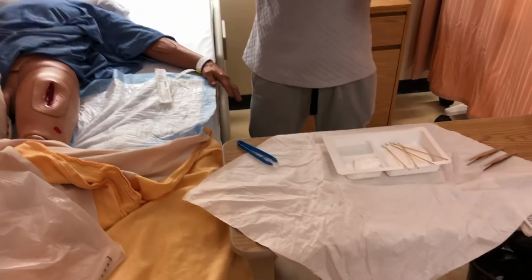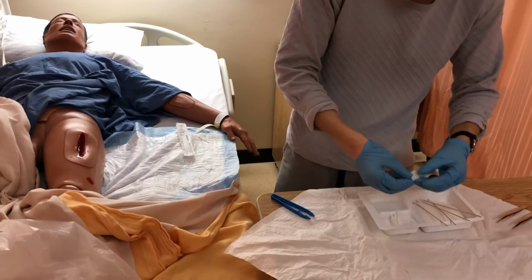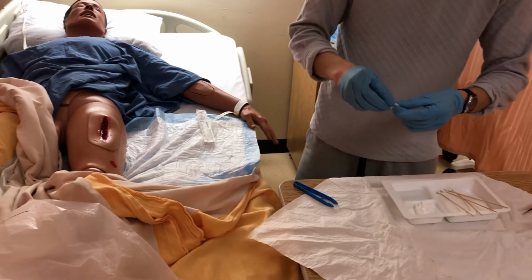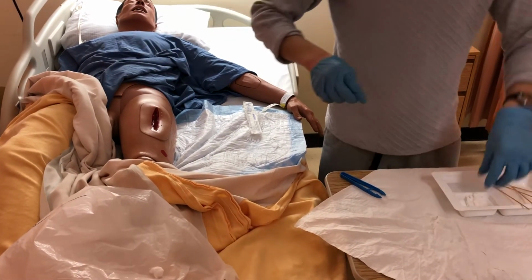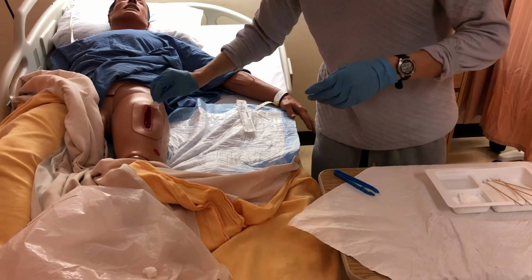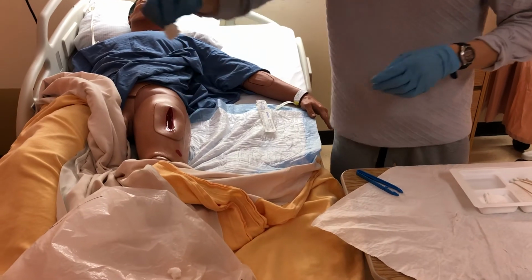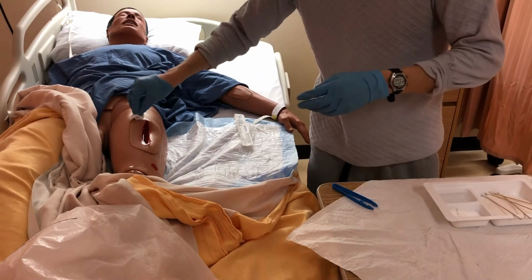And now I'm going to dry the peri-wound skin. So in order to dry it, I'm going to get my 2x2, make it into a rosette. I'm going to dry the skin outside furthest from me. I'm never going to dry the wound bed because it's going to remain moist for good healing. I'm going to dry the peri-wound skin outside nearest to me. And I'm going to keep drying until I get all the moisture out.